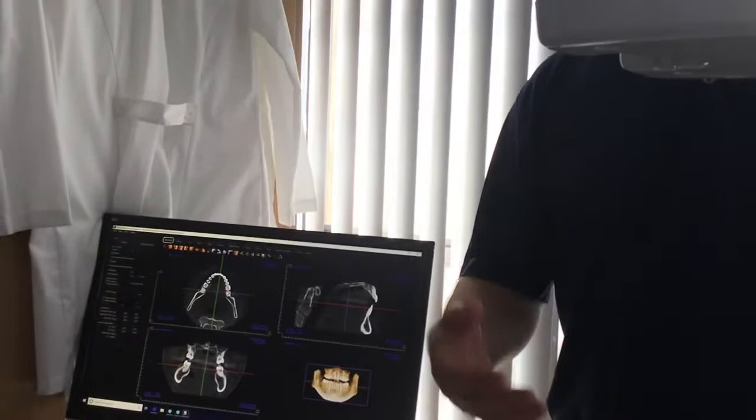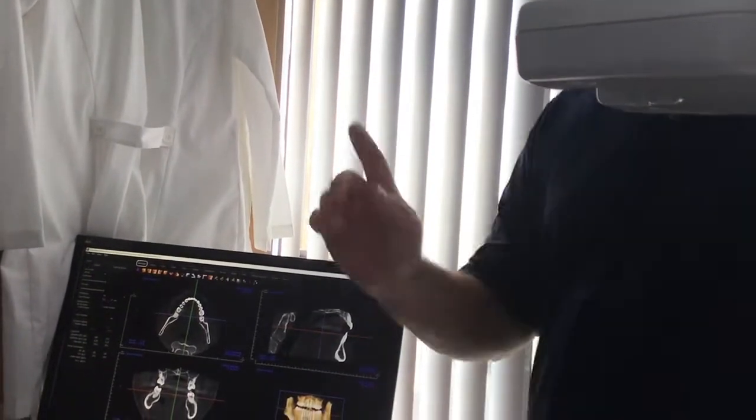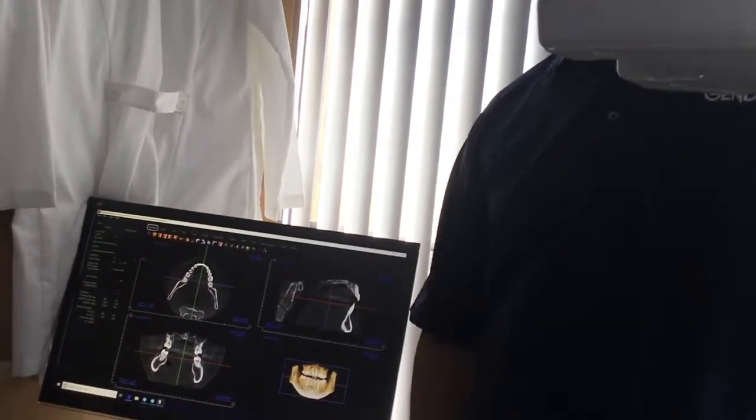We live in Florida, so I recommend once you power it off, wait about 10 seconds, then pull the plug out of the wall. We get a lot of lightning in Florida, so if it's not plugged into the wall, it cannot get hurt. So I just recommend unplugging it. That makes sense. I have to remember to plug it back in. People are like, I'm flipping the switch, is it plugged in? No. It actually happens more than you would imagine.